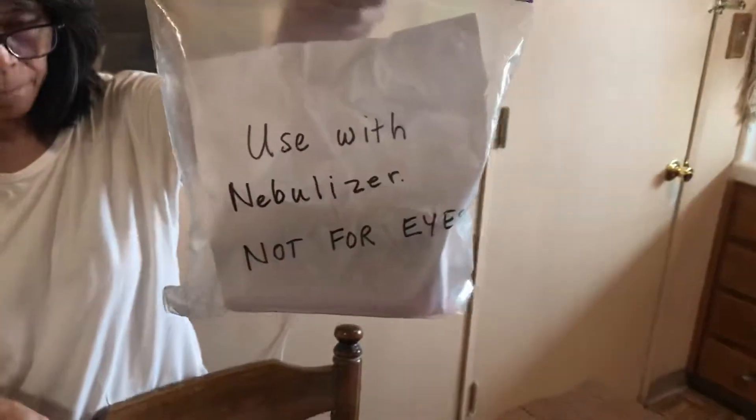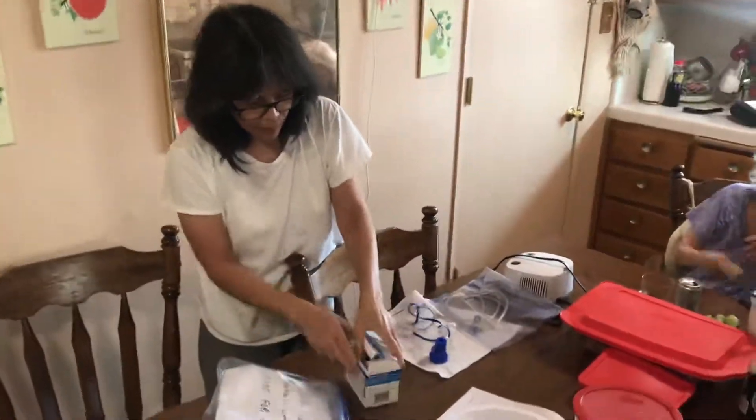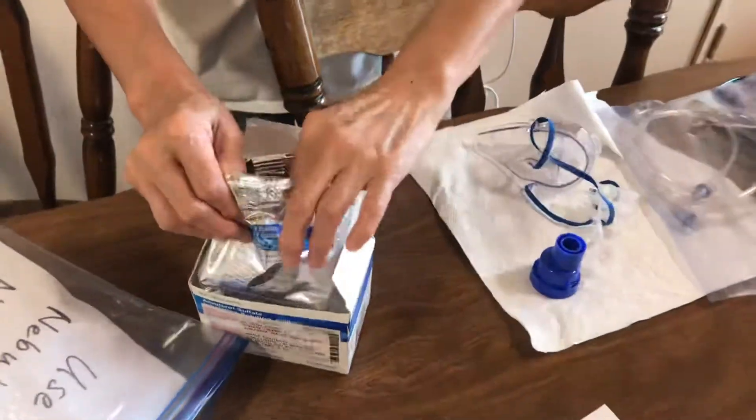This is in the refrigerator. I take out one of these vials.